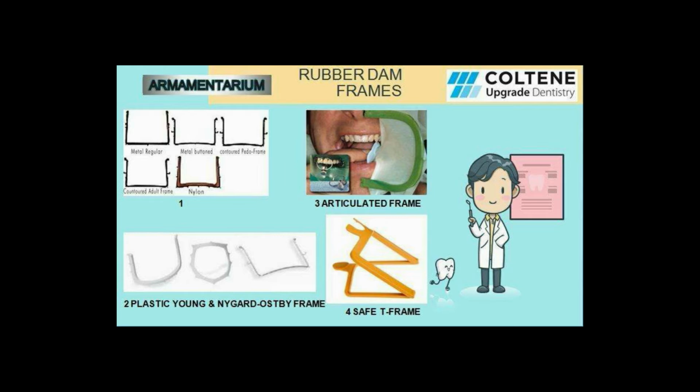The third picture shows a green color frame. This is a very interesting frame. This is an articulated frame. This frame can be easily folded over on its own, so that space is created where you can place your X-ray films or your sensors, or you can even administer local anesthesia again if you need to do that. So there is no need to remove the complete assembly and the frame to carry on your next work.